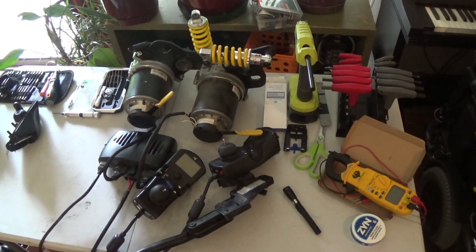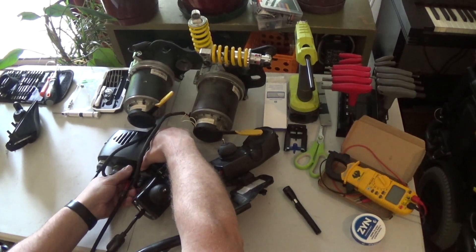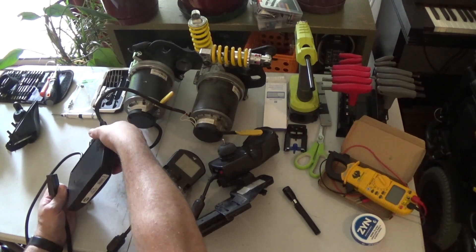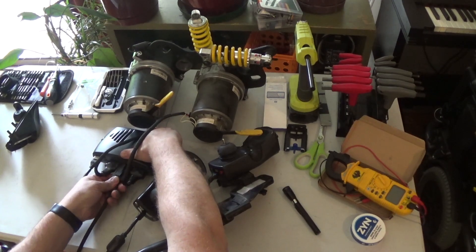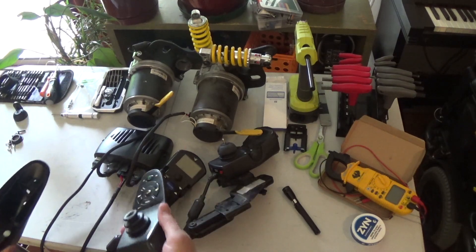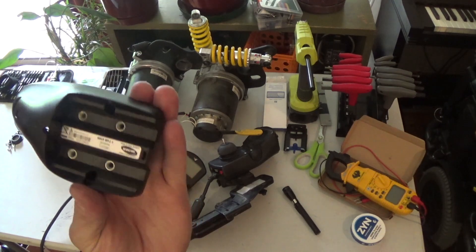We're going to start with a few different Invacare joysticks and Invacare control modules. The first one hooked up is a DKPMA02 or MK5 NX controller. This is MK5 and I've got it powered on 24 volts with a couple of batteries. We're going to start off first with this joystick, the one this controller was designed to work with — labeled as an MK5 SPJ Plus.